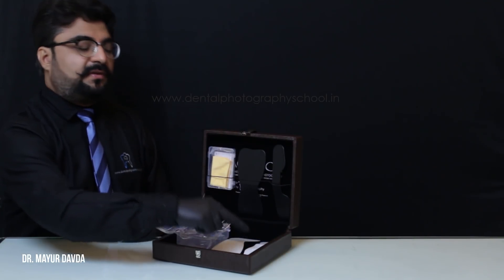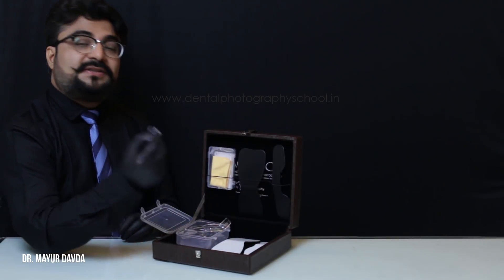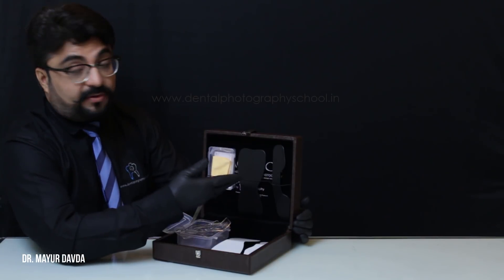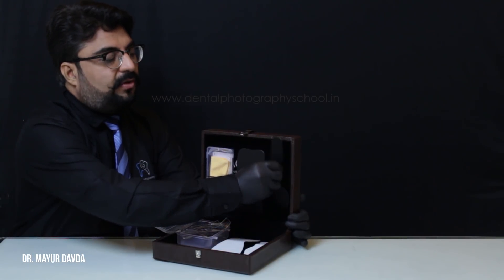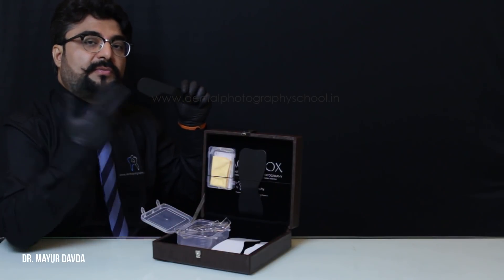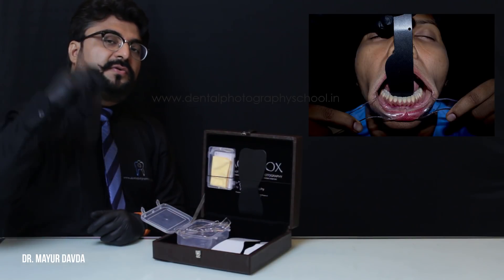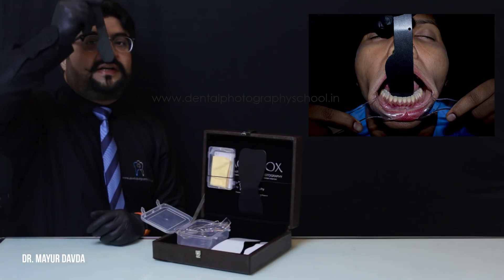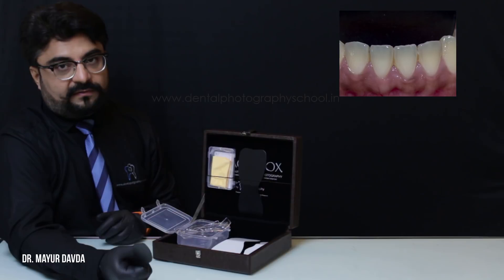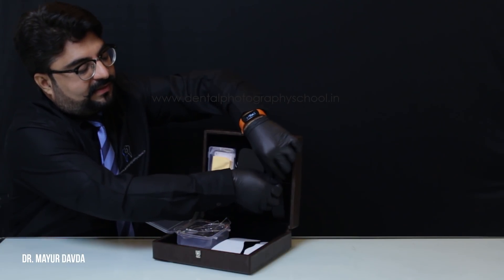I use the sectional mirror as well as the full arch occlusal mirror only with these sectional cheek retractors. Coming on to the aesthetic aspect, we give contrastors as well. The sectional contrastor is used for the buccal images to record the molar and canine relations, but the narrower part is useful to record the lower anterior aesthetic cases — it retracts the tongue and gives a beautiful contrast in front of your lower anteriors.